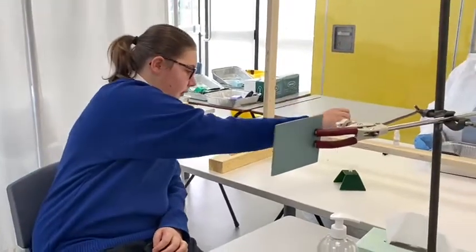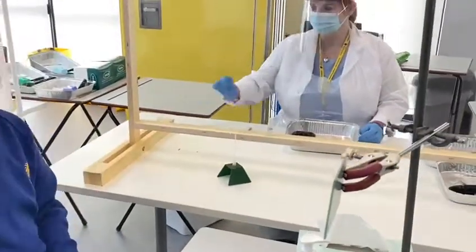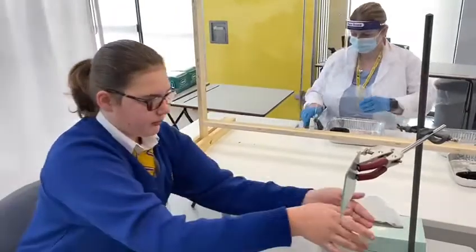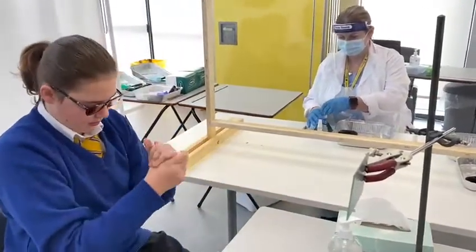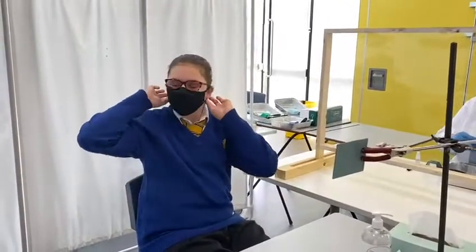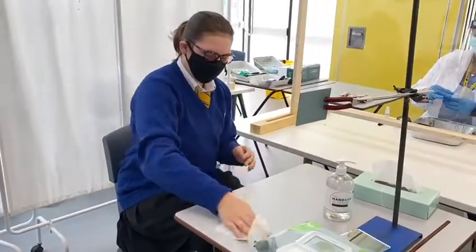And then place it swab side down into the test tube and hand the test tube to the side for Miss. Thank you. That's your test over — if you'd like to sanitise your hands again and replace your mask. And you can just help yourself to a wipe if you could just wipe the station down on the top of the bottle.